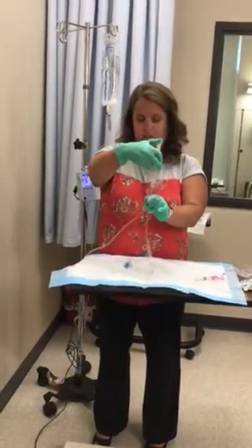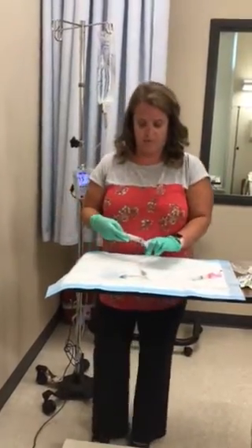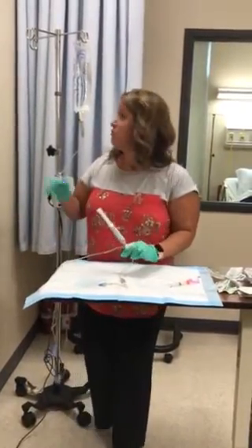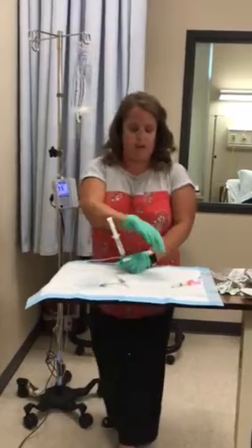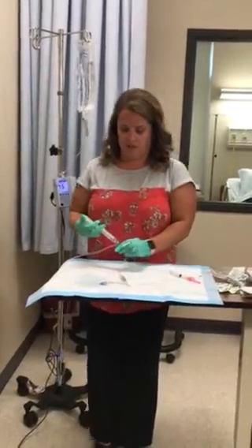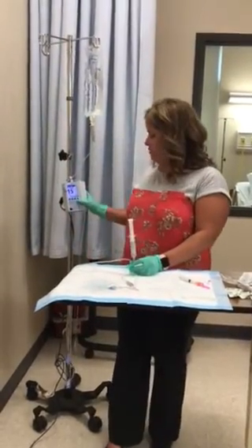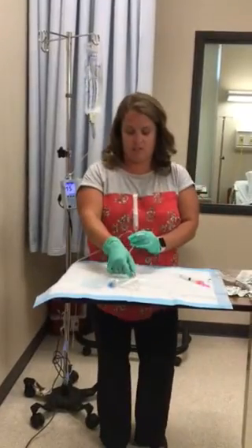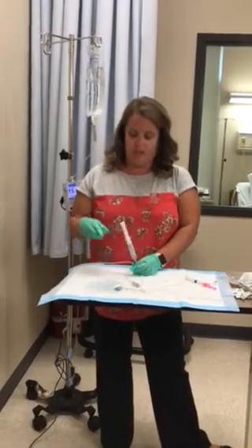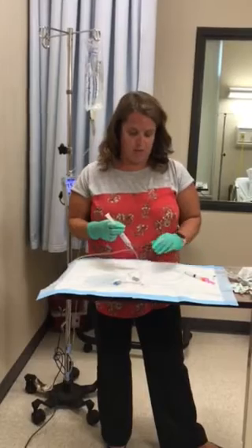You can occlude this right here and pull back to see if you get blood return. If you don't get blood return, that's okay. I know that normal saline is compatible with Toradol because normal saline is an isotonic solution. If it wasn't compatible, I would need to stop the fluids, disconnect the IV tubing from the extension port, flush saline, give the medicine, and flush saline again. But because I know it's compatible, I'm okay.